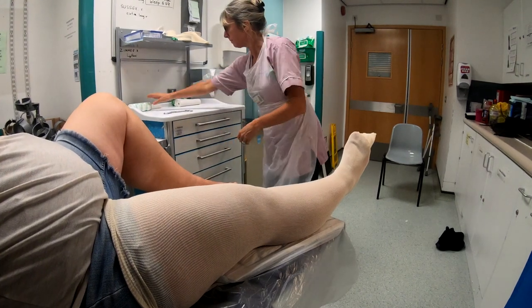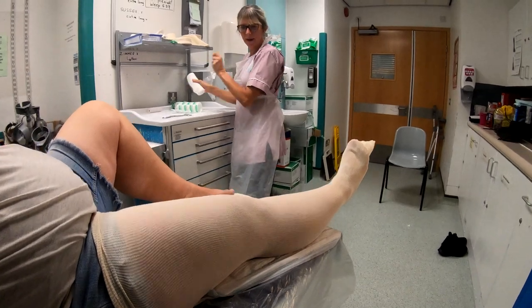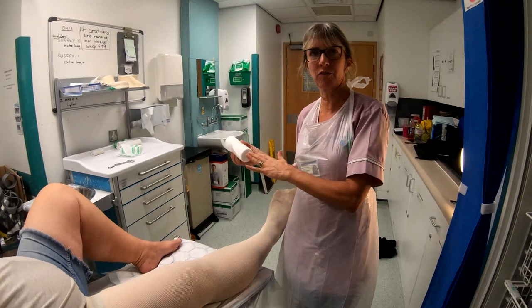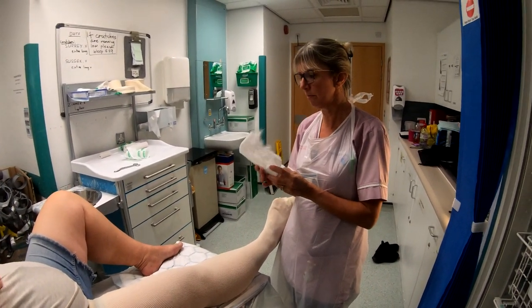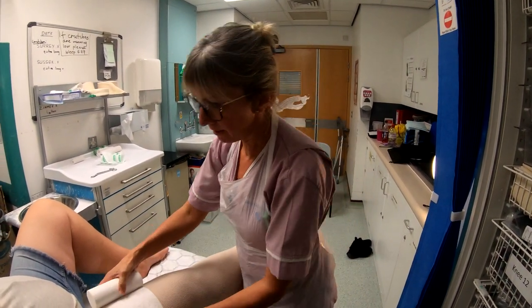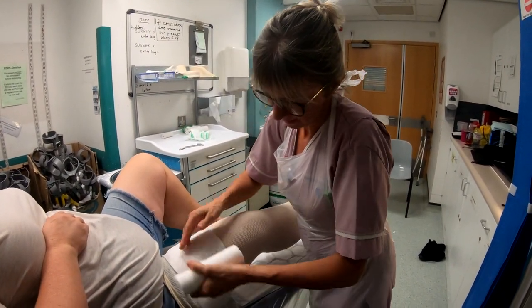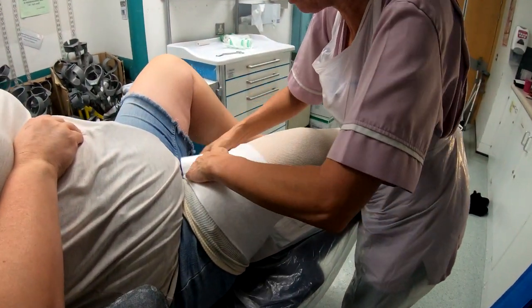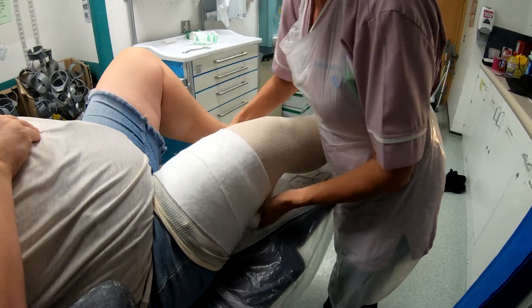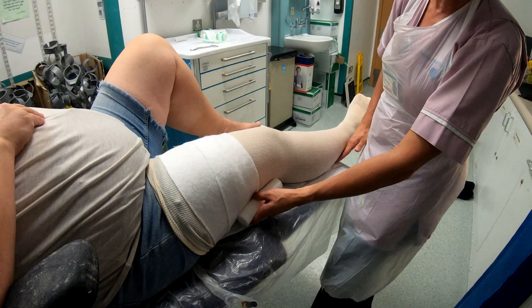So now the soft band. Of course, when someone's in pain, you might need somebody to help you apply this. You can cut all the plaster out ready first and then when you've got your group in to do the plaster, you can put this on then. But as my model here has no pain, we will do this now. Two layers, as close again as you can.